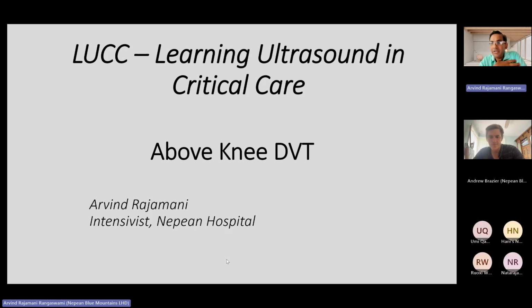How many of you have started doing diagnostic vascular ultrasounds? Yes, I did one last week. Right. See, it's actually extremely easy. Echo is the one that is the most challenging.